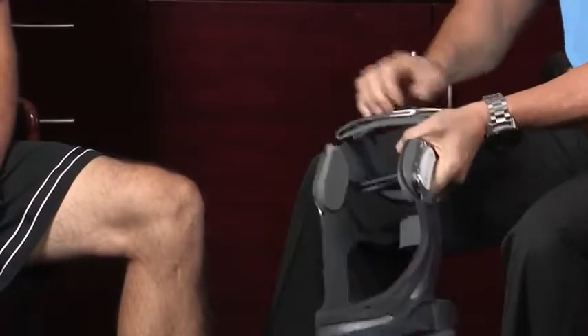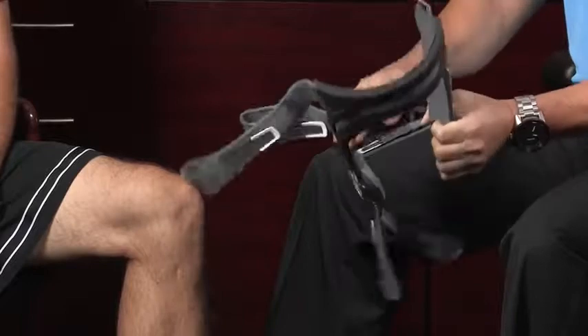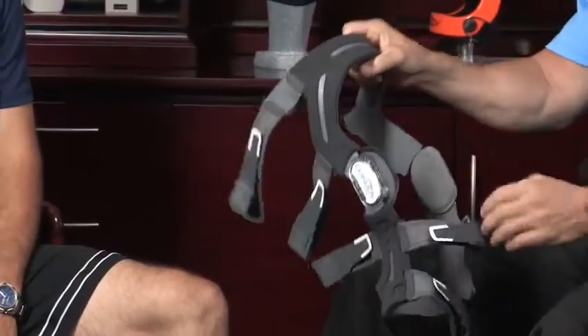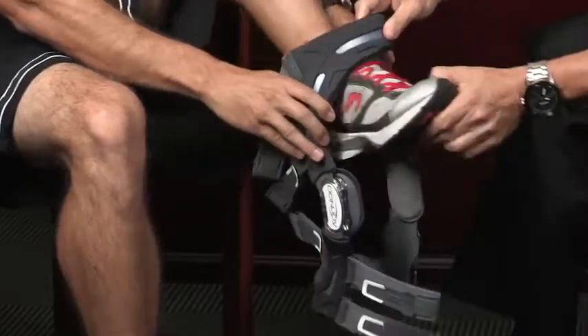You've got five straps on here. One thing to know while I'm doing this is that each strap is numbered, and there's a reason for that, because that helps the overall fit of the brace on your leg. It helps the technologies that evolve with the frame. So what you'll need to do is to step through the brace just like this.